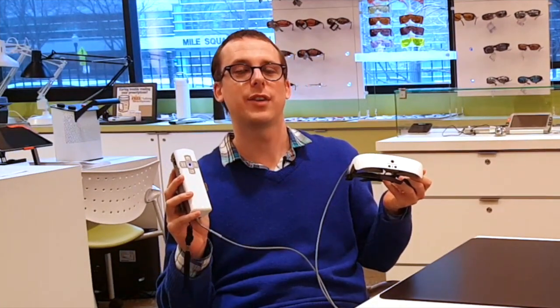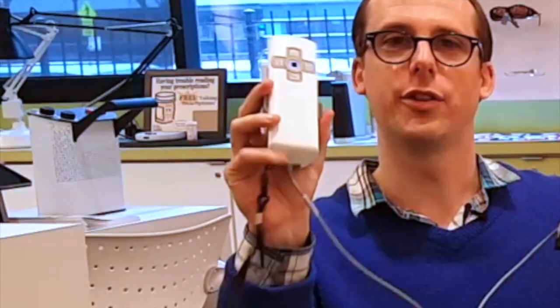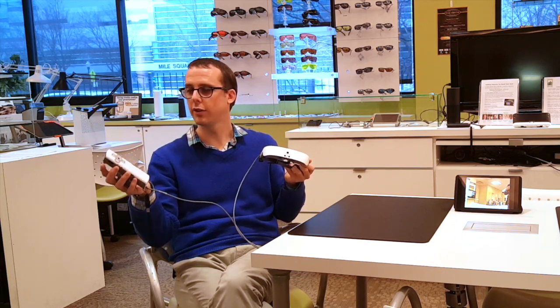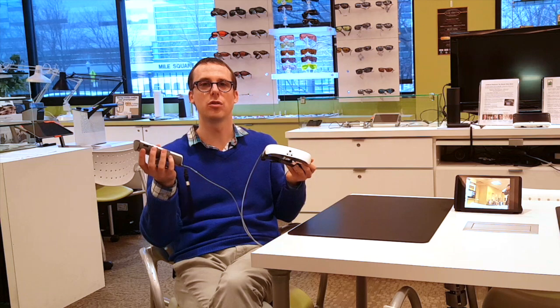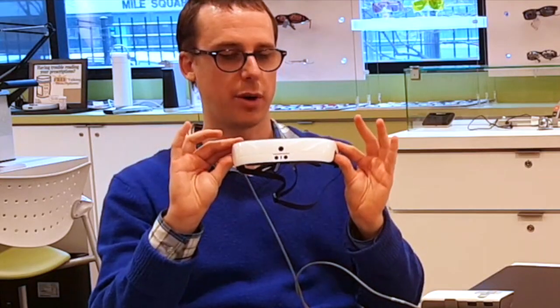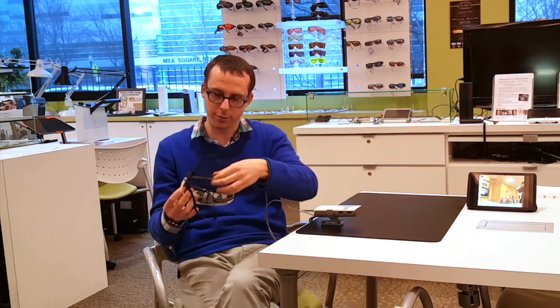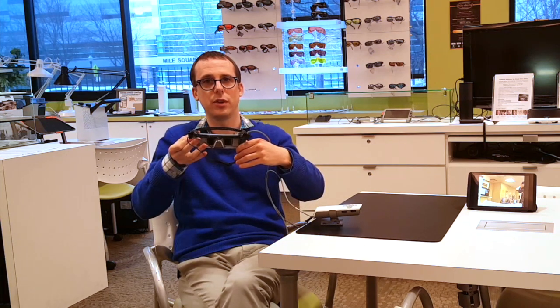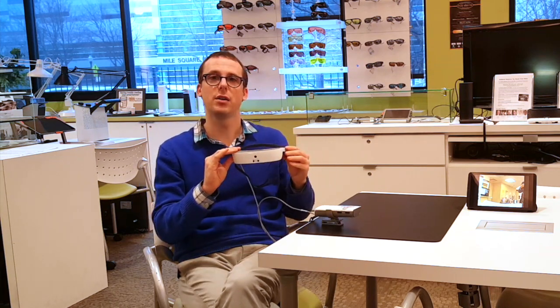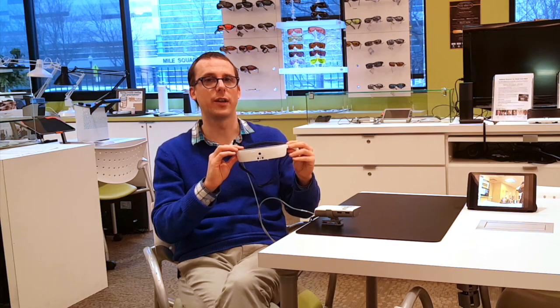In my hands here I have the new eSight 3. You may notice that this one has been very much reduced in size. The control panel is here in my right hand and looks somewhat like a TV remote — it has some buttons on the front and dials on the side that allow you to control the device. From there a wire connects to the headset, which is worn on the head. It consists of a camera built into the bridge, and on the inside there are a couple of video screens. Using this device we can magnify what we're looking at, improve contrast, change the color, freeze the image, and more.